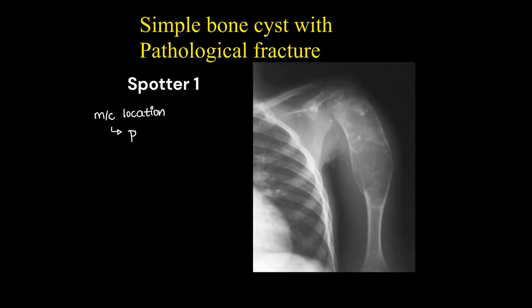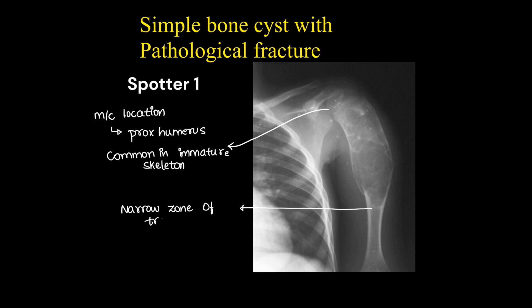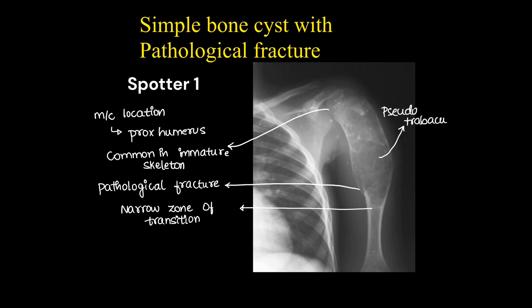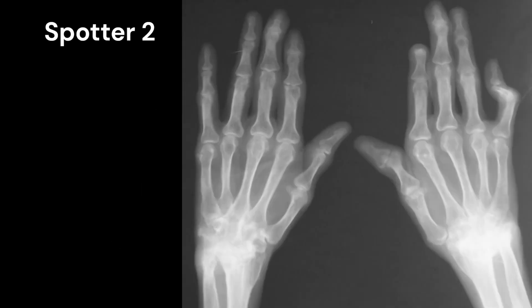This was a case of simple bone cyst with a pathological fracture. The most common location is the proximal humerus, as shown in the picture. It is common in immature skeletal. There is a narrow zone of transition for this lytic lesion. Here you can see the pathological fracture and pseudotrabeculations. There will be no periosteal reaction.